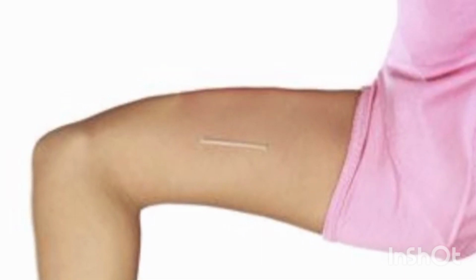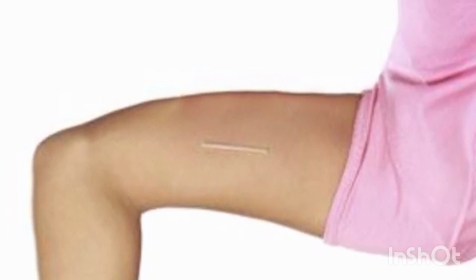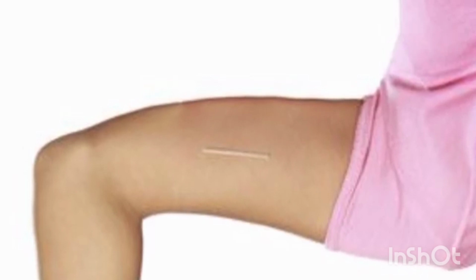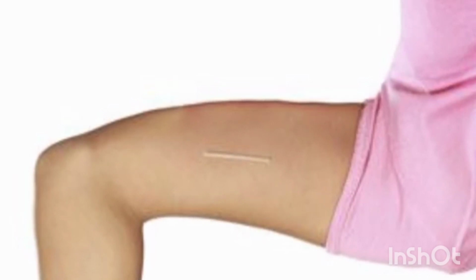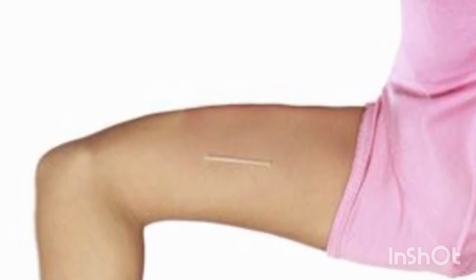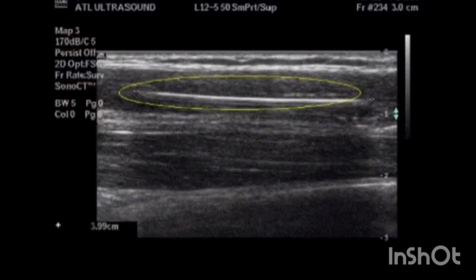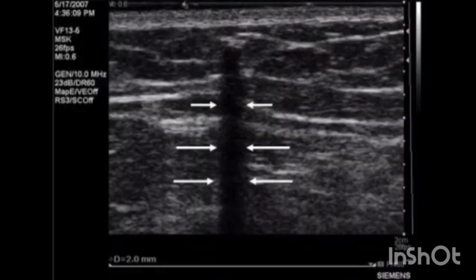In this way, the patient's left inner upper arm will be exposed, since most Jadels are often inserted in the left upper arm, and in that position, the left upper arm is closer and accessible to the sonographer. The ultrasound gel is being placed on the arm at the desired position following the insertion scar or spot where the rods are palpable. The implant is best visualized by ultrasound on a transverse plane as an echogenic spot with a hypoechogenic shadow, shown on the white arrow as above.